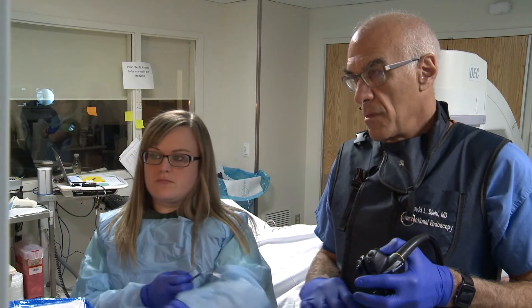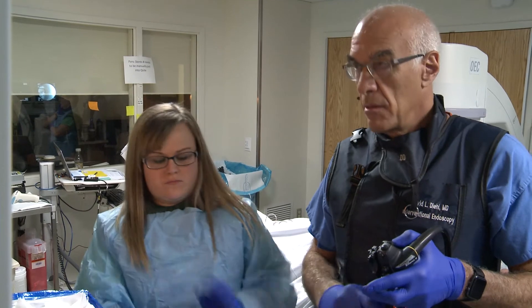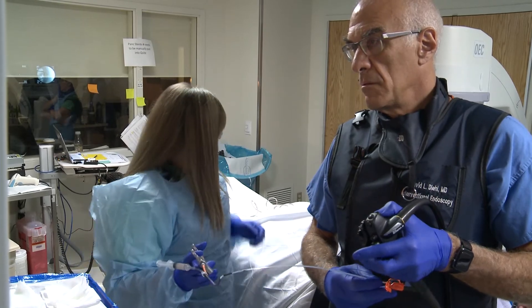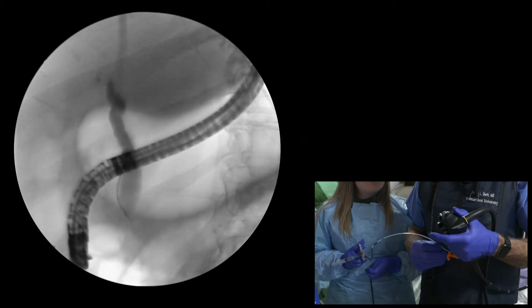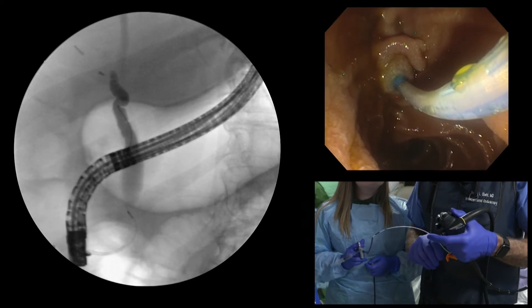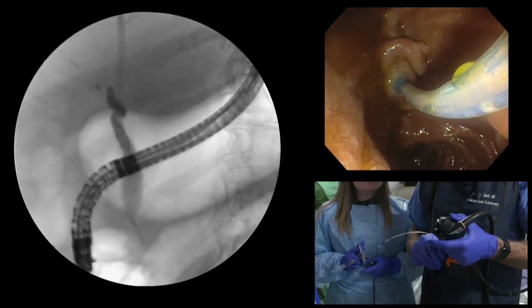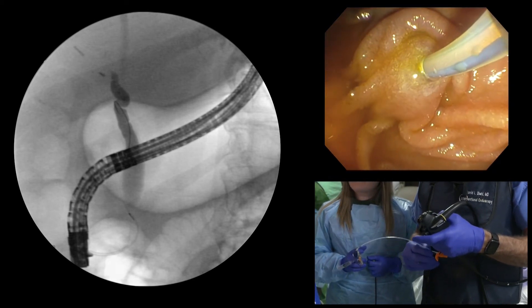Historically, cannulas and sphincterotomes were long wire devices, requiring a 450 centimeter guide wire to go through the length of the instrument. However, with strippable sphincterotomes and catheters, short wire ERCP guide wire manipulation has become possible. The advantages of using a short wire system versus a long wire are several — first and foremost, the assistant and endoscopist don't have to worry about an extremely long guide wire getting out of control or falling on the floor; a short guide wire is much more manageable.